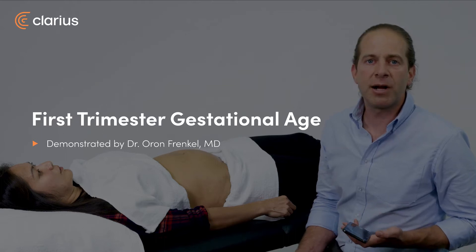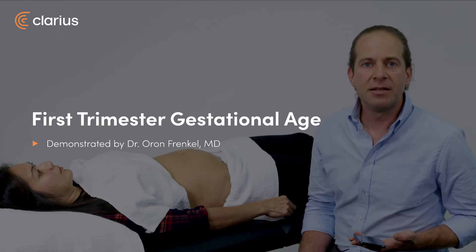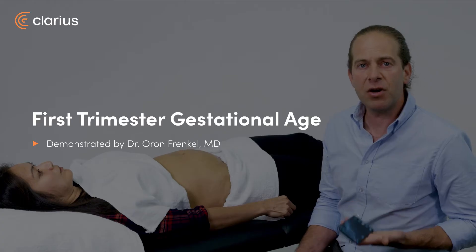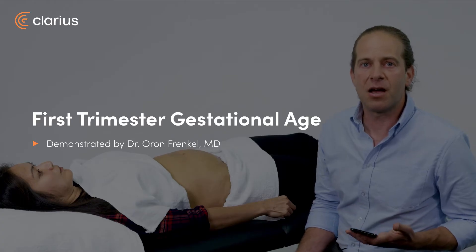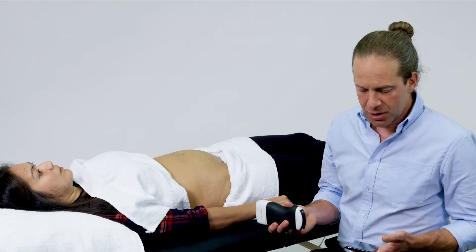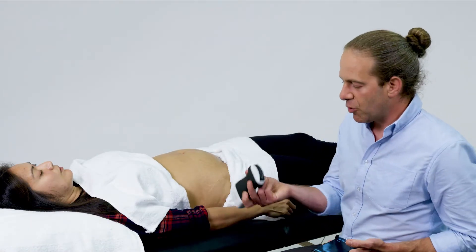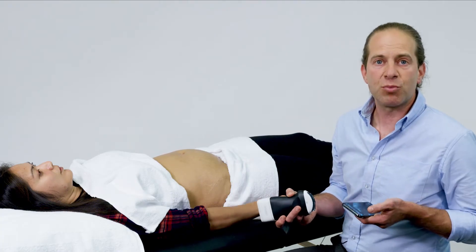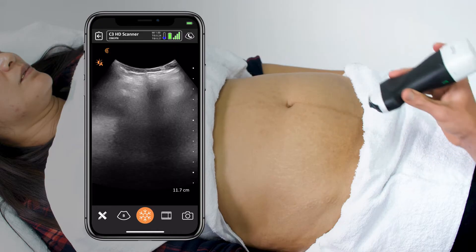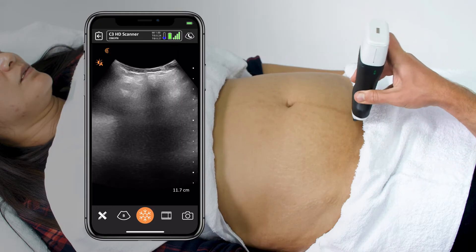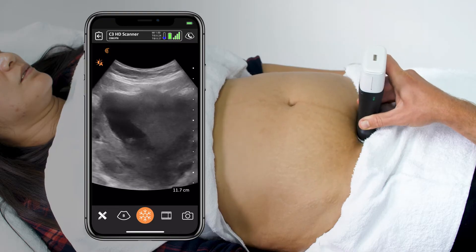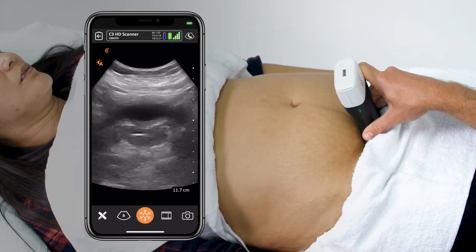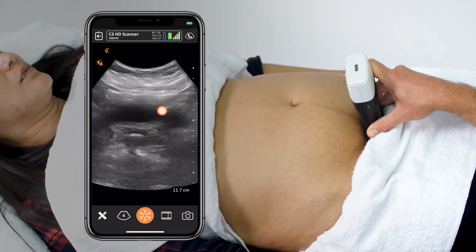In a patient with a first trimester pregnancy, gestational age dating can be accomplished very readily at the bedside with a couple quick maneuvers. To do this scan, I'm going to use the curvilinear transducer on an obstetrics preset. I like to place the transducer in the transverse orientation just above the pubic bone and aimed deep into the pelvis to identify the bladder as my first landmark.